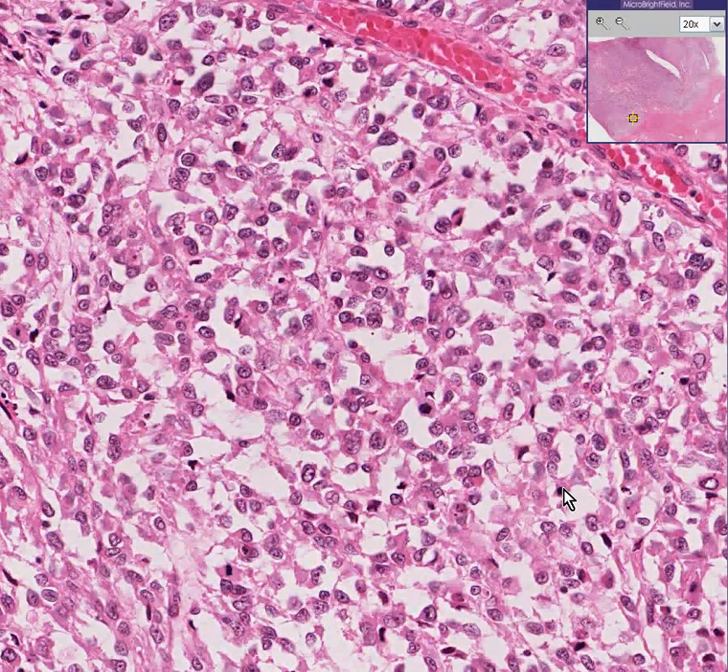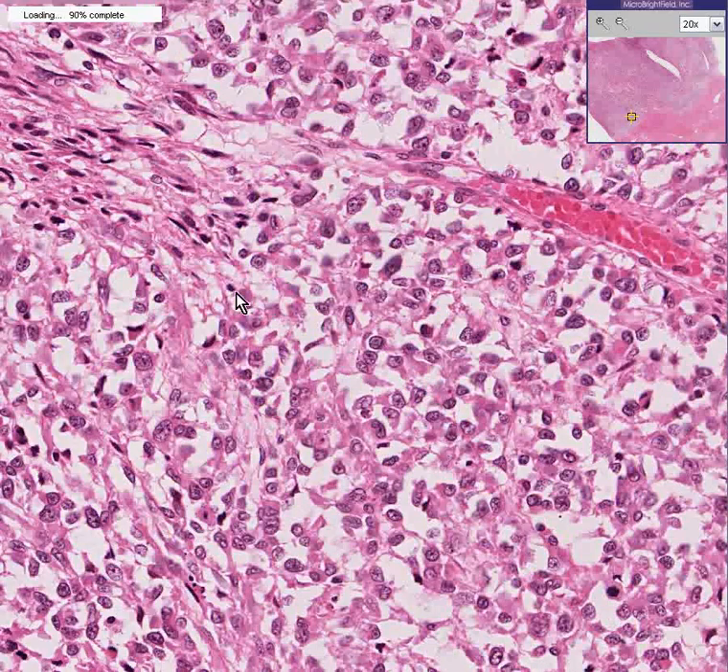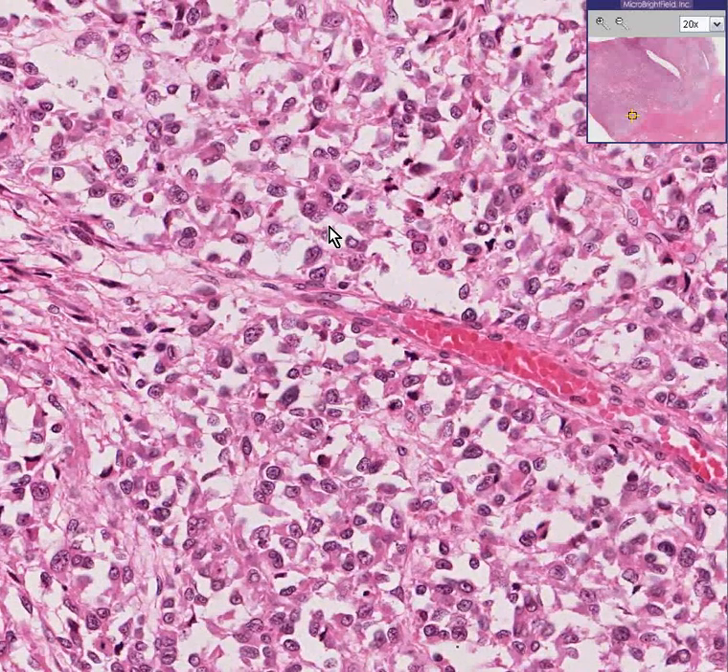So if we are convinced this is smooth muscle — and we are, because parts of it look exactly like smooth muscle — but we can see more than two, three, or four mitoses per 10 high-power fields, we are then able to diagnose that this smooth muscle tumor is not benign, but malignant. This is a leiomyosarcoma.